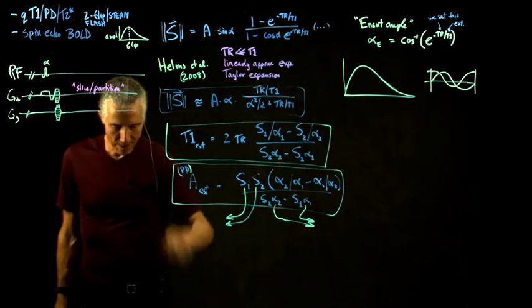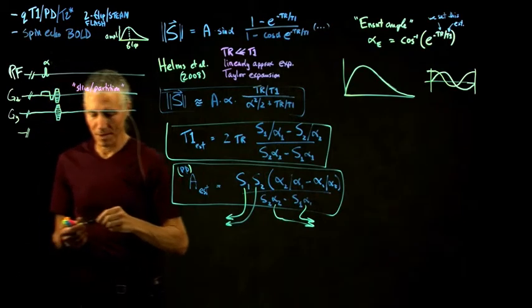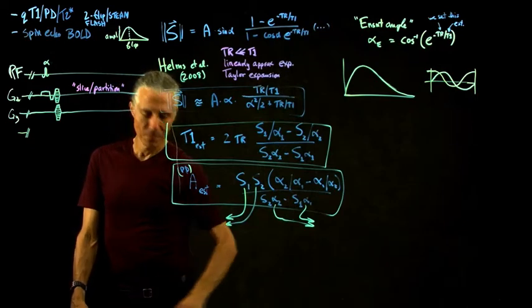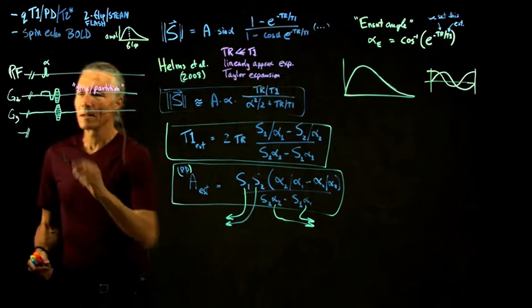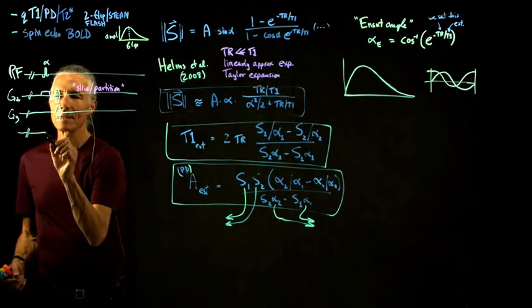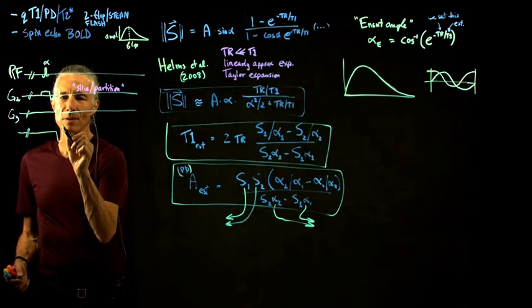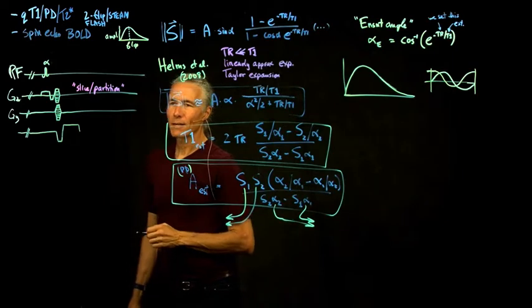The one thing that's a little bit different about this sequence, which was written by Nicholas Weiskopf and Martina Callaghan in London, is that you collect more echoes. When you collect a gradient echo, that's the standard gradient echo.